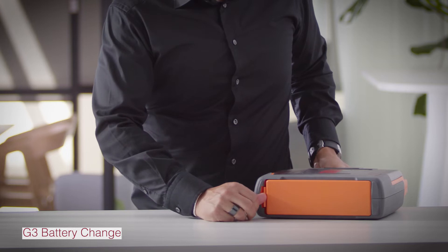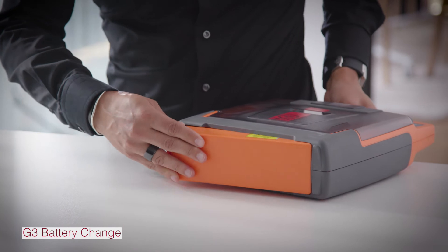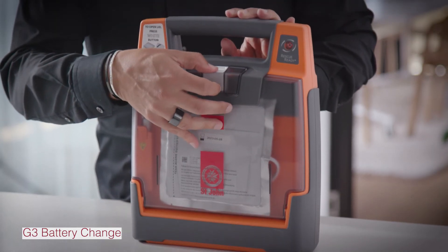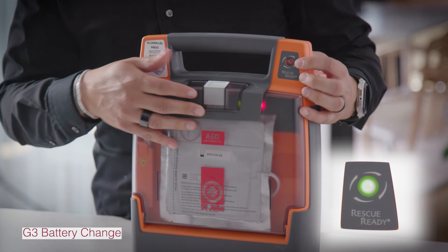Now I'll show you how to change over your battery. Press on the latch to release the battery. The battery only goes in one way. When you hear the click, it's secure. Open the lid of the device and the rescue ready indicator will go green.